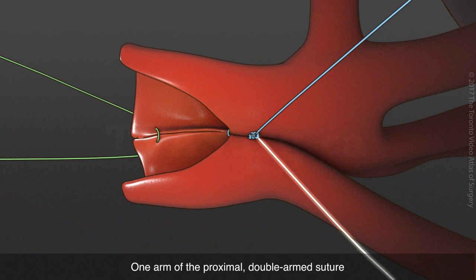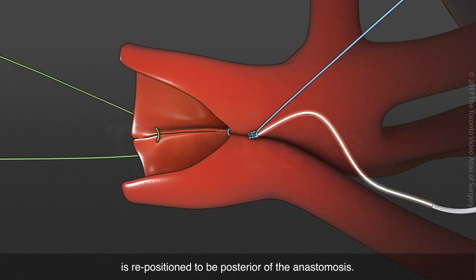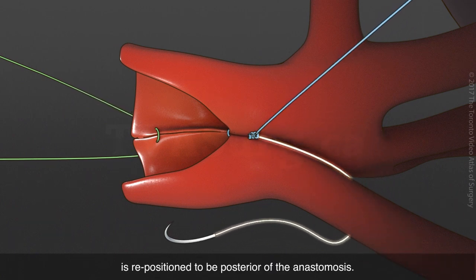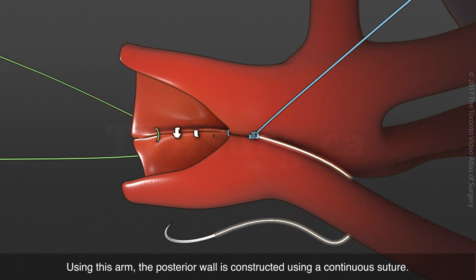One arm of the proximal double-armed suture is repositioned to be posterior of the anastomosis. Using this arm, the posterior wall is constructed using a continuous suture.